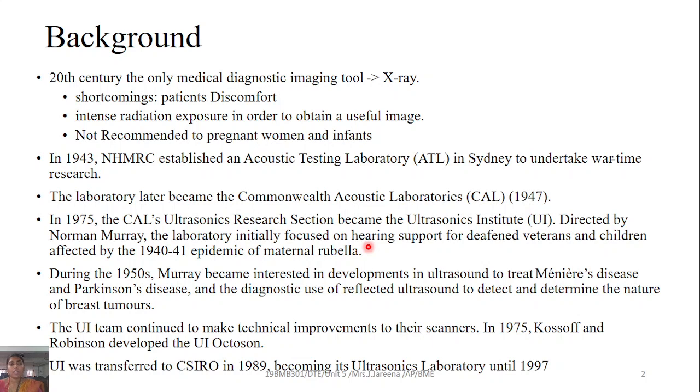If you take the beginning of the 20th century, there is only one medical diagnostic imaging tool with us, that is the X-ray. We know what is meant by X-ray, right? X-ray is one of the imaging modalities which is meant to image the tissue with the help of X-ray radiation. The disadvantage of X-ray is patient discomfort, because the patient needs to stand for a period of time till the diagnostic process is completed. So this is going to be a discomfort for the patient during the treatment.